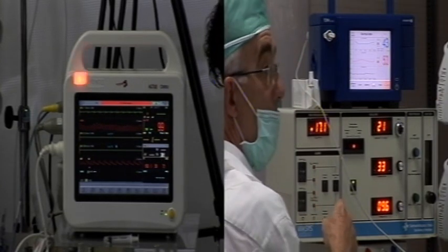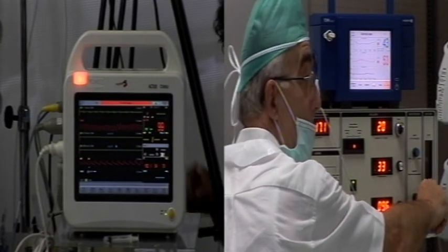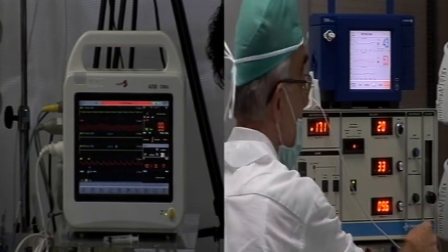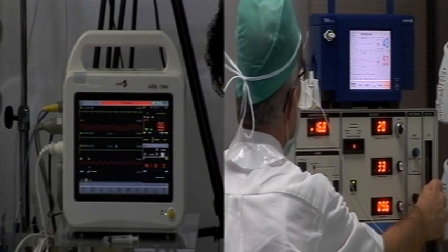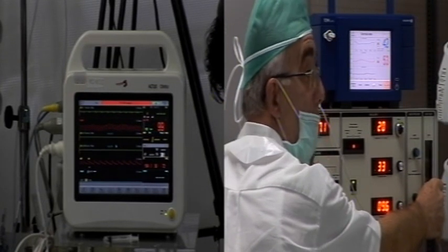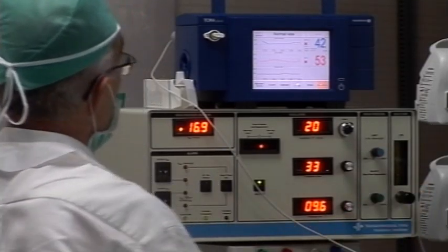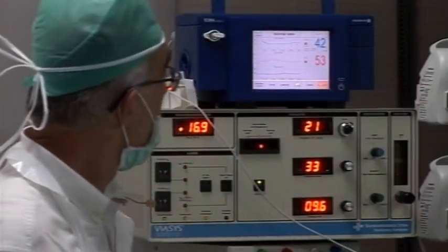So at this point, if I go too high, I will increase here the CDP, and we will see how high I can go before this valve is activating. You see? I cannot go further.